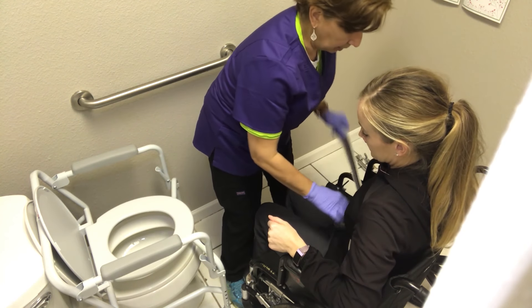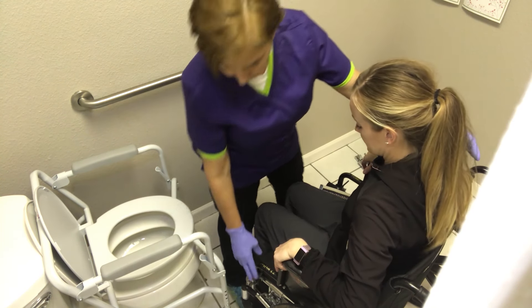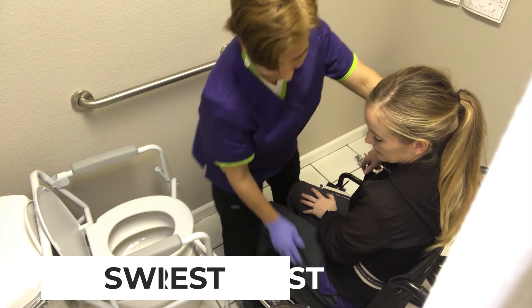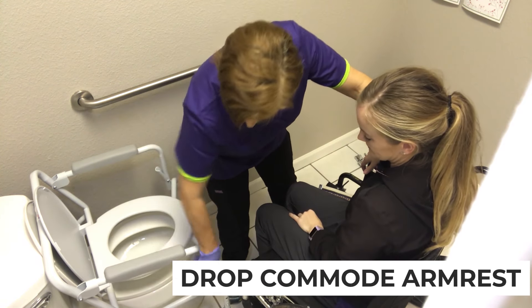They're not able to stand very well, so we're going to scoot over. This wheelchair has swing-back arms — some armrests come off, but this one happens to swing back and out of the way. It also has a drop arm where it just kind of drops out of the way.